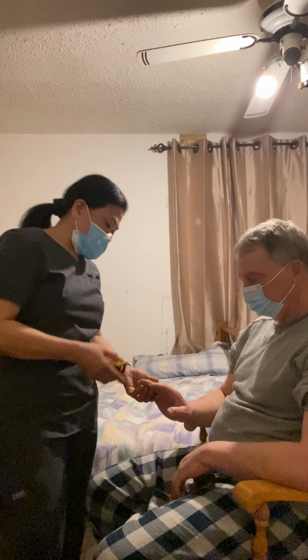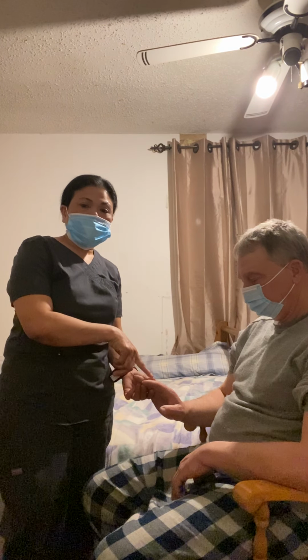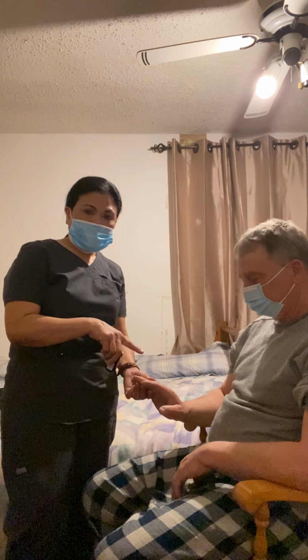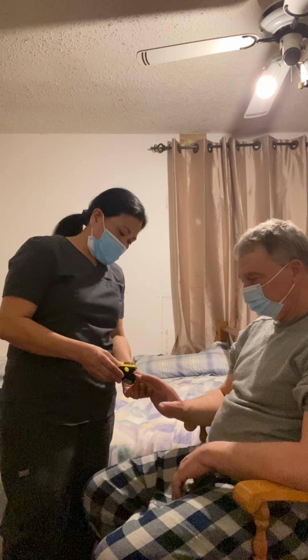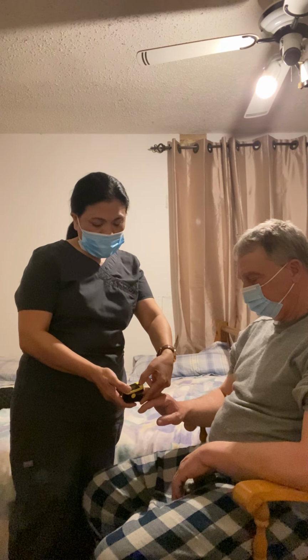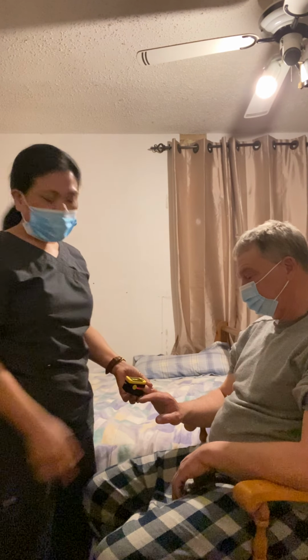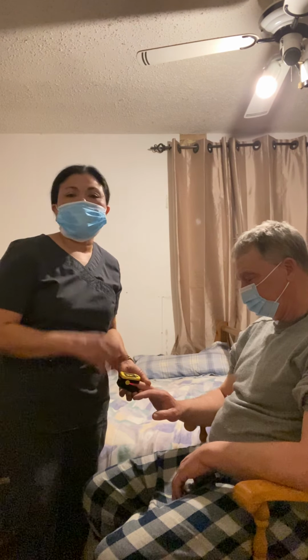We make sure that we choose a finger that has nice circulation and is warm and soft, and we place it there and then turn it on. Then we wait for the readings.